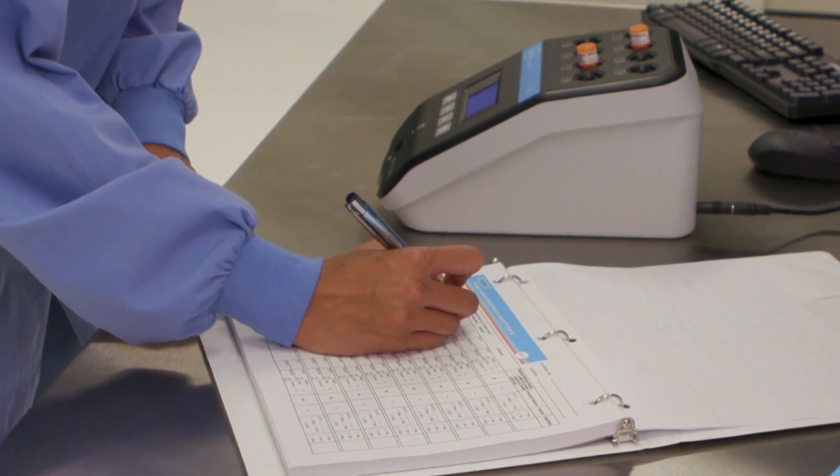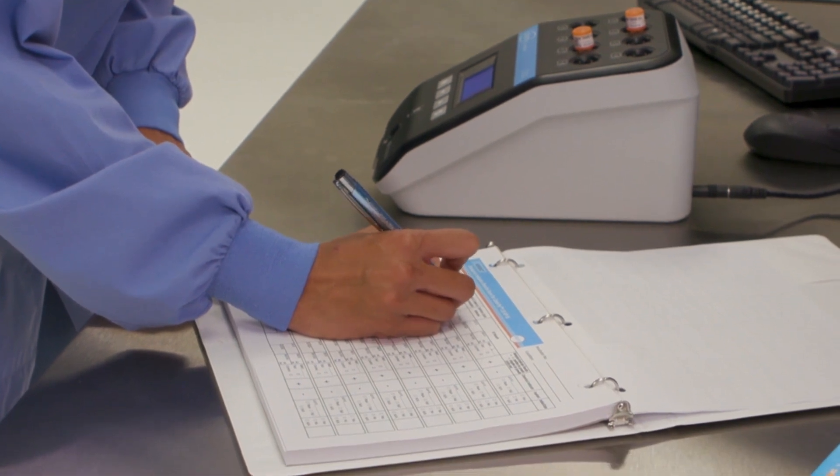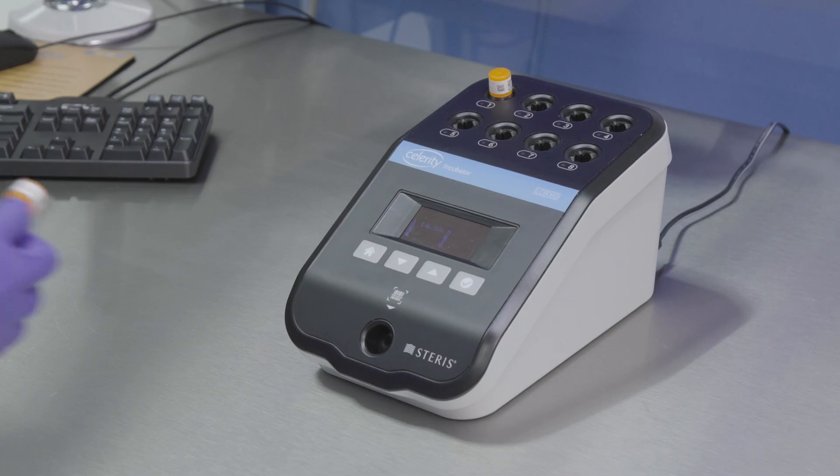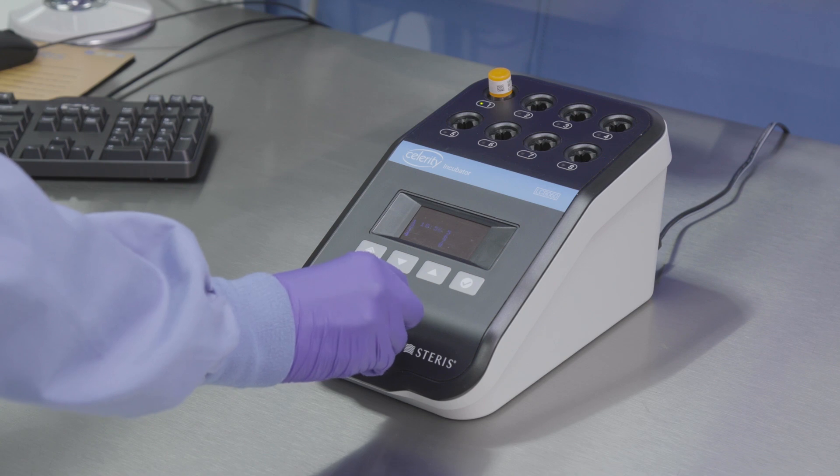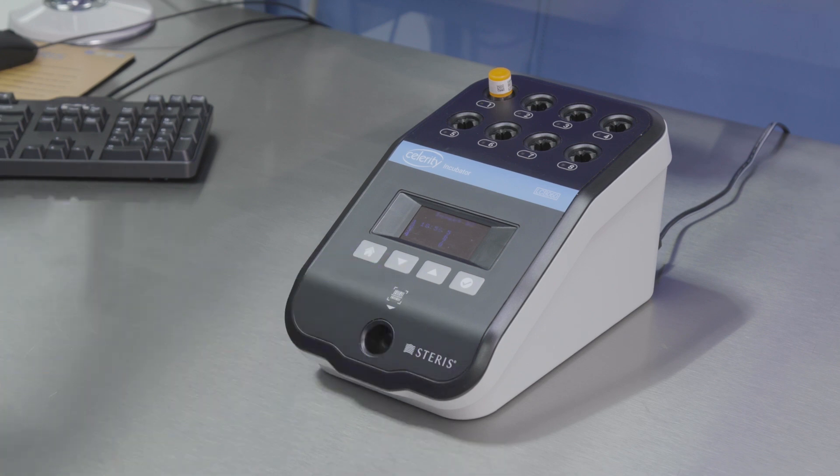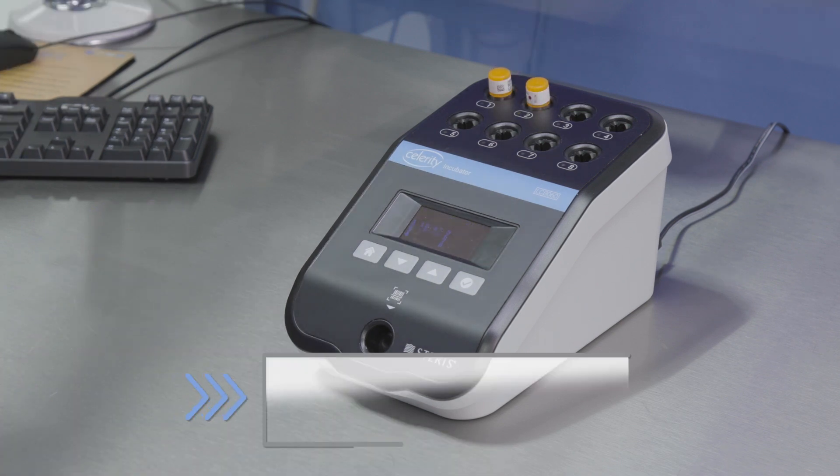Biological controls should be performed each day a test BI is used and whenever a new BI lot is used. Scan and activate an unexposed control BI as previously described. Identify the BI as the control and place the control BI in the Celerity incubator.